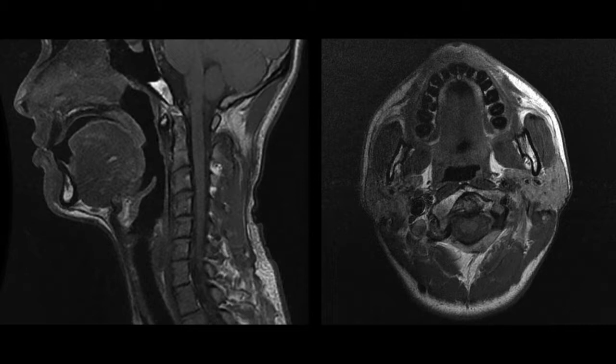So MRI has been used for OSA evaluation for quite a while. Static MRI of the upper airway has been around for decades, usually to identify anatomic locations of all the relevant soft tissues, and it's typical to acquire 3D scans with multiple different contrasts that each take about 2 to 4 minutes to acquire. So 2 to 4 minutes per scan and maybe 5 to 7 scans total. It's about a 30-minute exam. The images produced are gorgeous. They're very crisp, and you can delineate all the relevant soft tissues, but they're static.